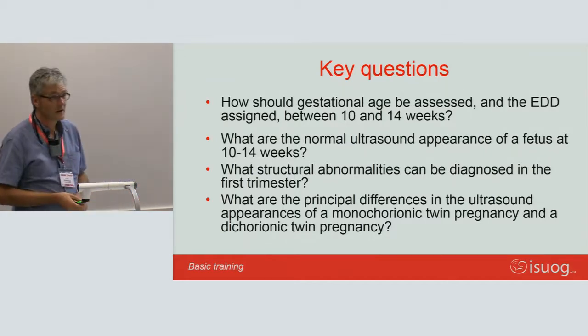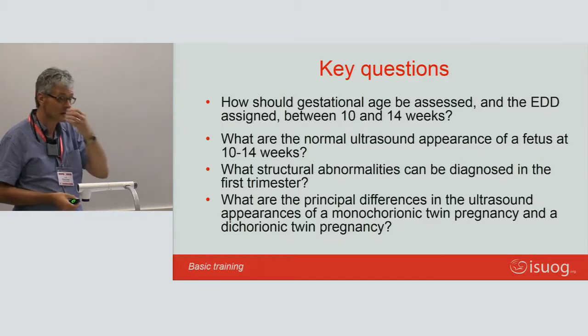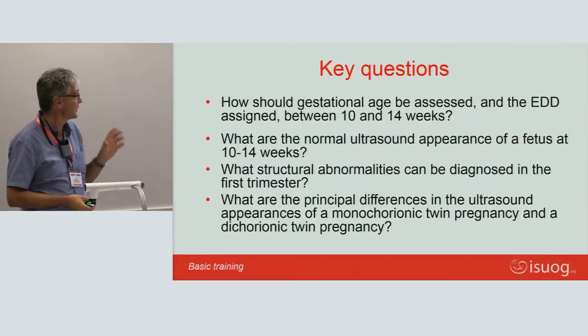And then which structural abnormalities can you, as mostly basic scanners, when you start scanning on Monday, hope to diagnose in this time period?